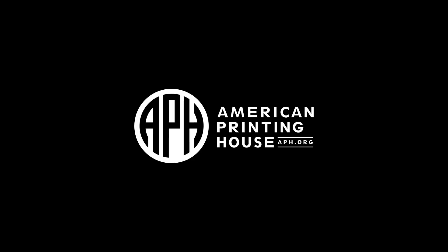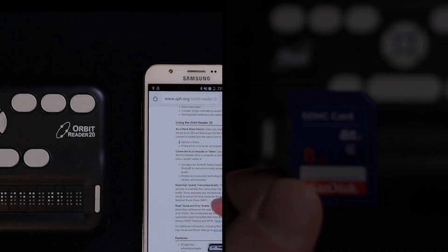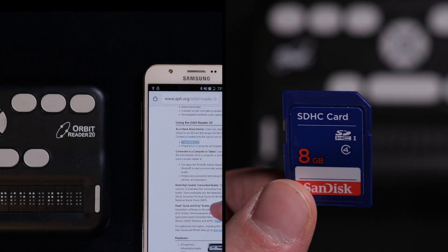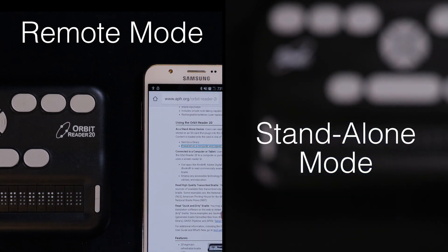Welcome to the APH video: Getting Content on your Orbit Reader 20. Your Orbit Reader has two modes for reading content: remote and standalone.